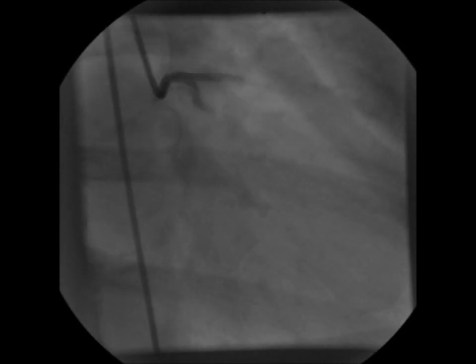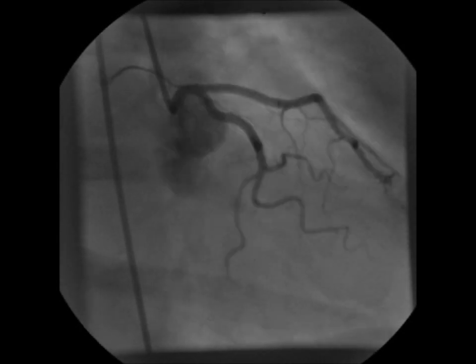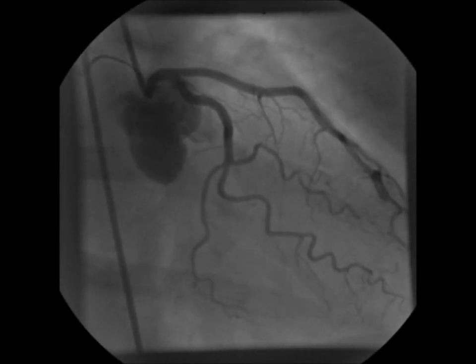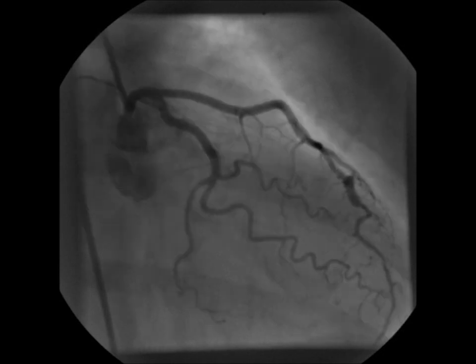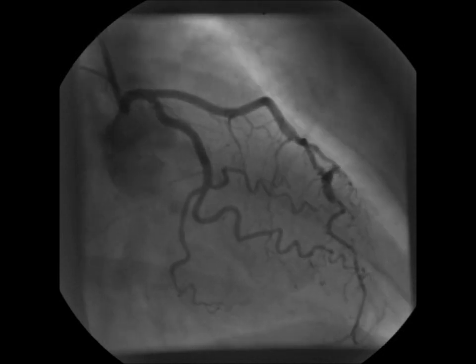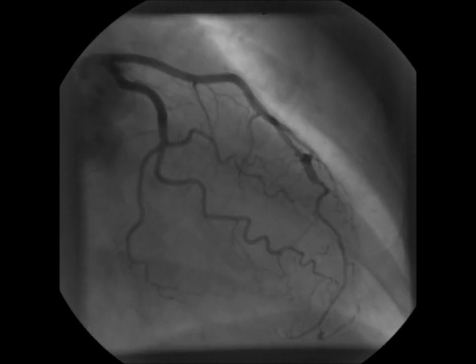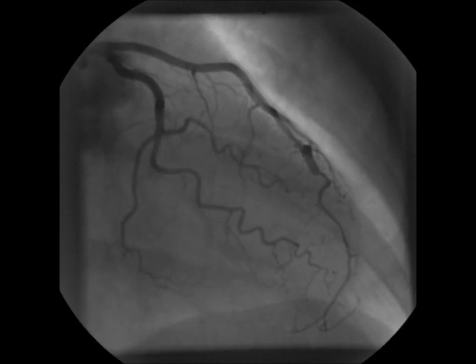Currently, there is a medical application that uses a catheter ultrasound system to image the inside of a heart. The CMUT is an emerging technology that provides promising advantages for improving the quality of these images.